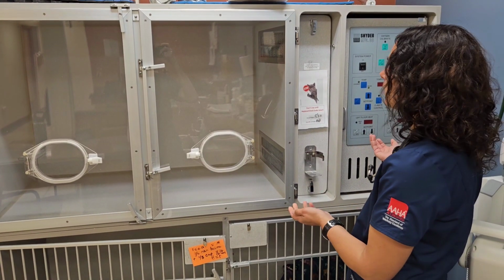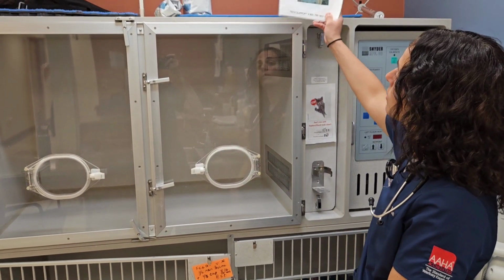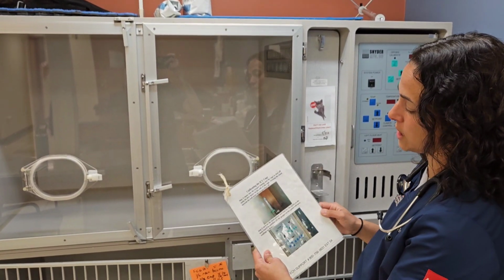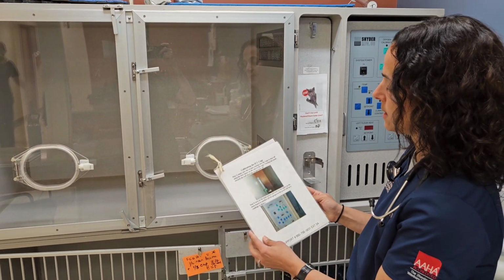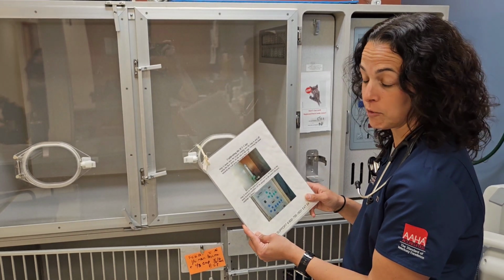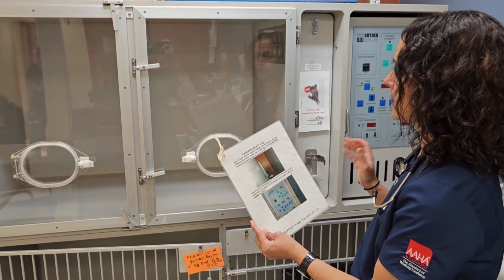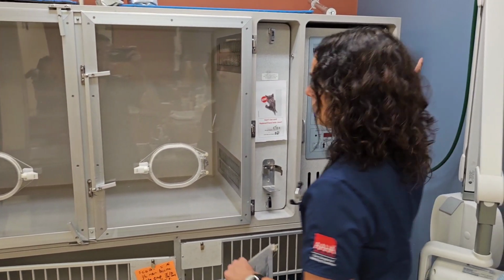Hello, we're going to talk a little bit about how to work the oxygen machine. The best place for a resource is right on top. There are instructions on how to calibrate it, how to use it in general, and how to change the settings, and this really is the best place to go, other than this video of course, to figure out how to set up the oxygen machine.